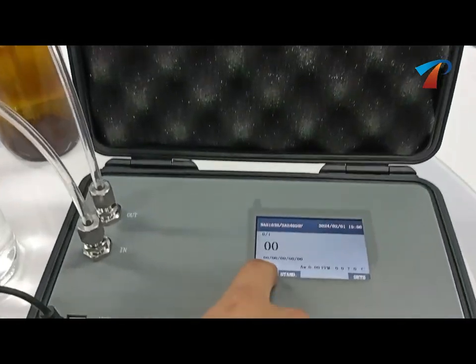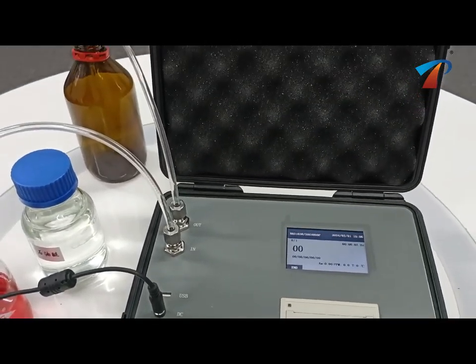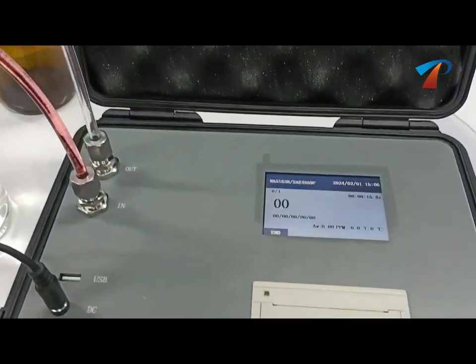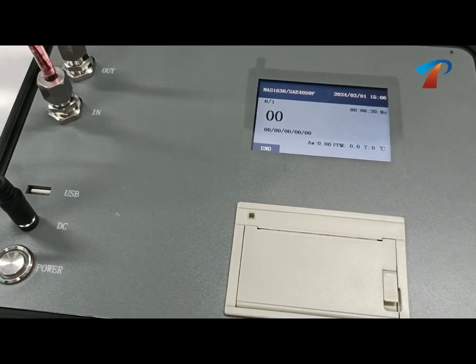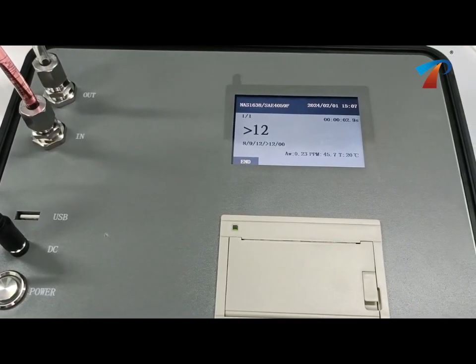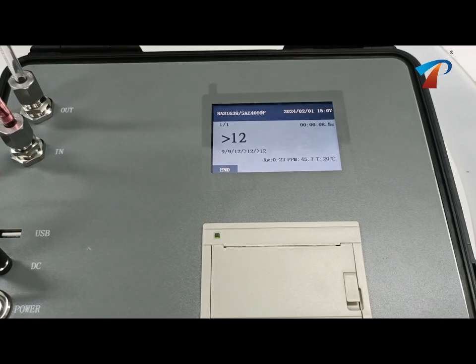Select a standard and click sample on the test interface. You can see that the grade is not displayed at the beginning of the test. This is the process of washing according to the volume of washing. The test starts. You can see the number of tests and the current test level, and it will be automatically printed after the end of the test.